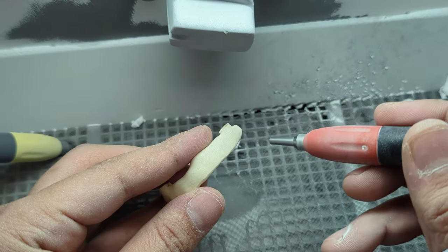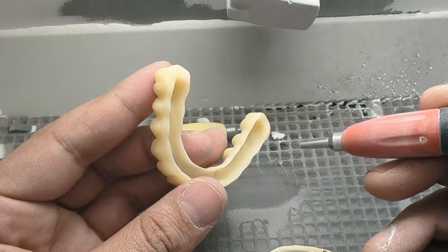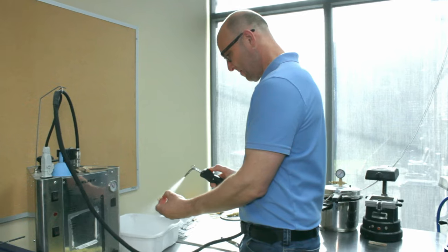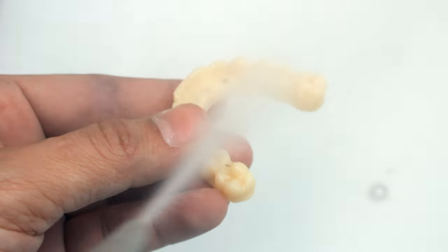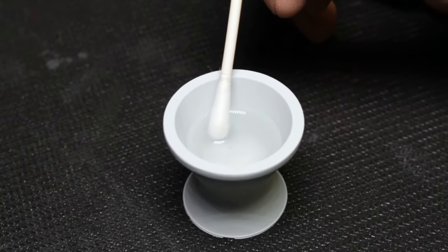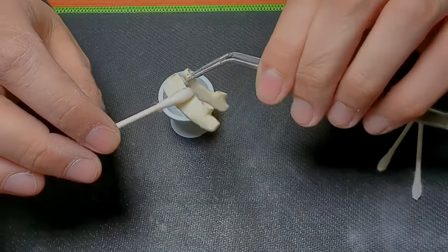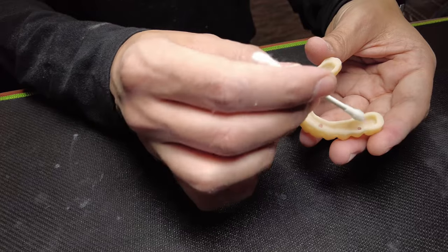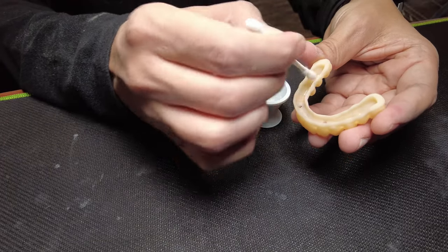Therefore, I steam clean both jacket and bar and sandblast both with aluminum oxide 110 micron at 2 bar. After that, I gently clean the surface with pressured steam. It is a good idea to use cleaning alcohol to prepare the surface of Trilor and nano ceramic, as it helps to get them ready for further work. Using a cotton swab, I carefully clean both materials to remove any remaining dirt or oils.